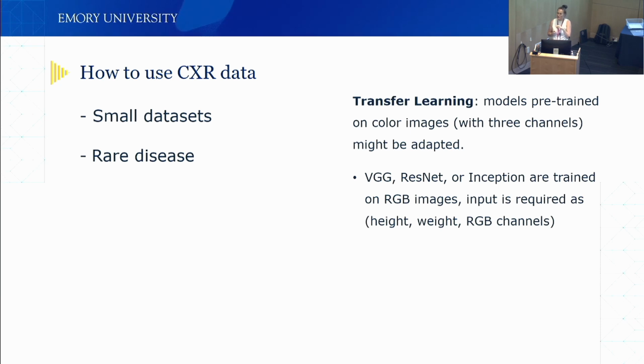What we see now is, as an AI, we can do lung nodule detection, you can do pneumothorax. There are algorithms with AI that can do that. There are algorithms now that say, hey, we search for only urgent diseases. So we do pneumothoraxes, intracranial hemorrhage, different types of diseases that you can see on CT or X-ray. And they say, okay, if we see a pneumothorax, we flag it, and then it gets a priority score, and it goes over a patient that the AI says is normal. So it prioritizes based on AI, which means it's very dependent on your AI accuracy.